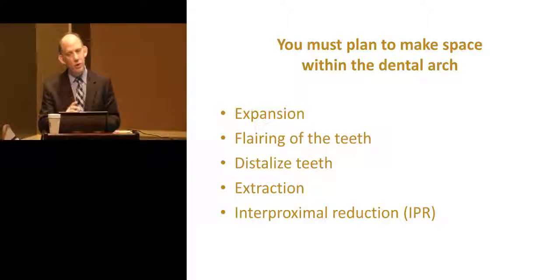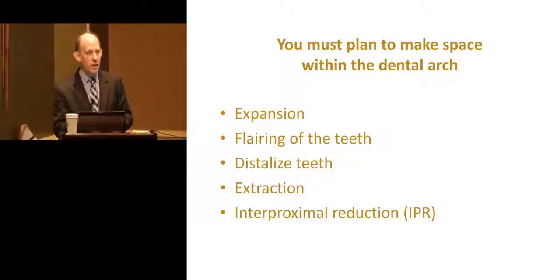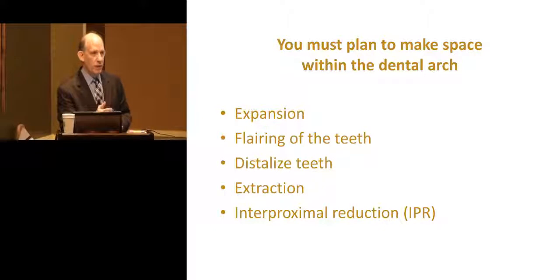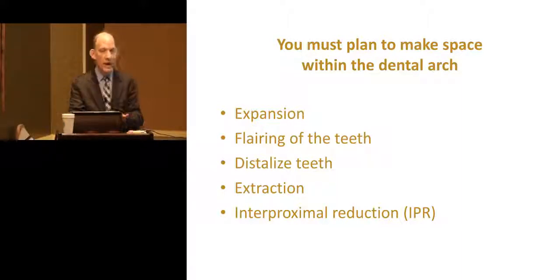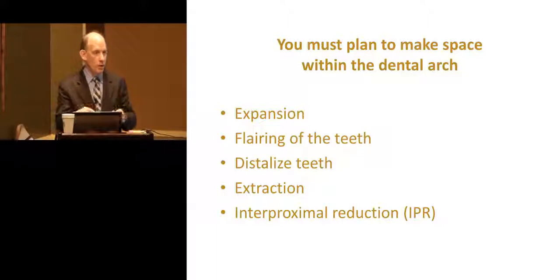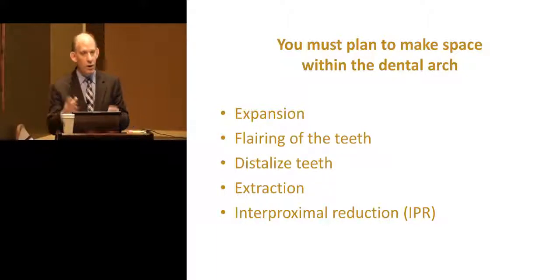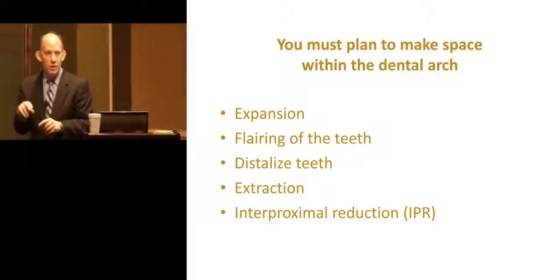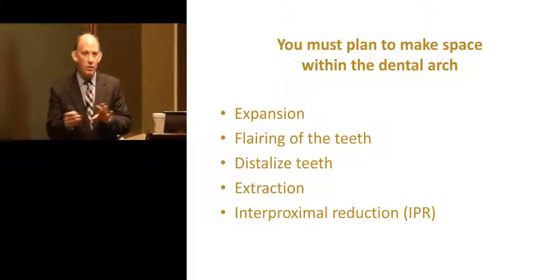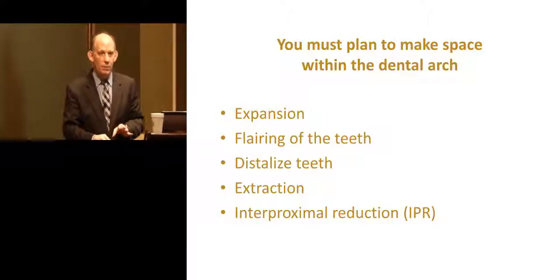And what's weird about changing the shape of teeth is if you take 1/10 of a millimeter off of a tooth, it doesn't mean that you can close 1/10 of a millimeter of space. Because when you change the contours of teeth, you can legitimately get the teeth to close closer together. When you're talking about an incisor that's very flare-shaped, and you make it more parallel-shaped, not only are you bringing the teeth closer together, but you can close up what we refer to as black triangles.